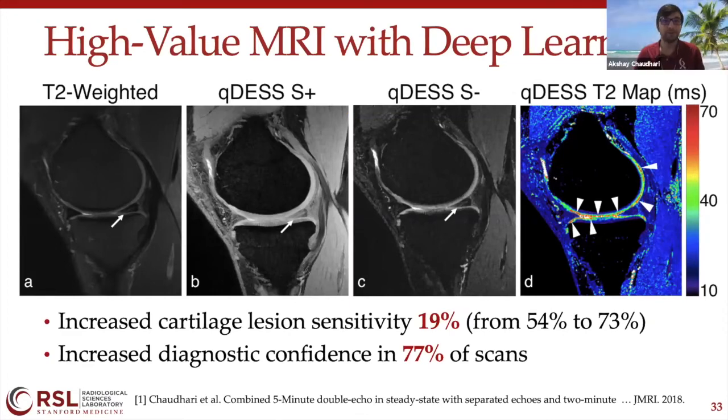Yeah, I think the articular cartilage here looks much thicker than in the T2 weighted scan because the contrasts that we're looking at are much different. This articular cartilage is actually divided into separate subsections that people tend to refer to as deep cartilage, which is at the interface of the bone surface. And that has different MRI relaxation parameters. And in this T2 weighted scan, a lot of that deep cartilage has actually decayed away. The signal from that isn't really existent in this image. That is why we're mostly seeing the superficial layer of cartilage.